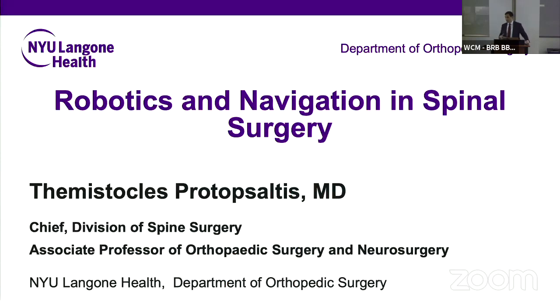You certainly wouldn't be able to register the vascular anatomy, and I wouldn't feel as comfortable with that or a large tumor if I was working at the OC junction or something. That's not going to translate very well. But bony anatomy, with respect to segmental registration on preoperative imaging, is probably pretty decent. I haven't used it yet, though, so I don't really know.